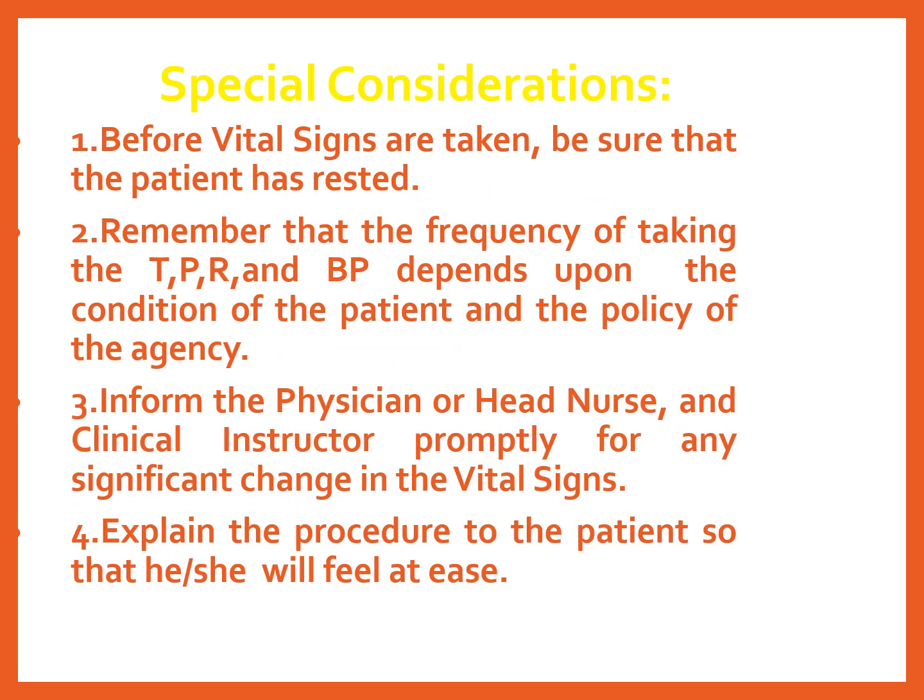These are just some of the special considerations when taking vital signs. Number one, before vital signs are taken, be sure that the patient has rested. Number two, remember that the frequency of taking the temperature, pulse, respiration, and blood pressure depends upon the condition of the patient and the policy of the agency or your hospital. Number three, inform the physician or head nurse and clinical instructor promptly of any significant change in the vital signs. And number four, explain the procedure to your patient so that he or she will feel at ease.